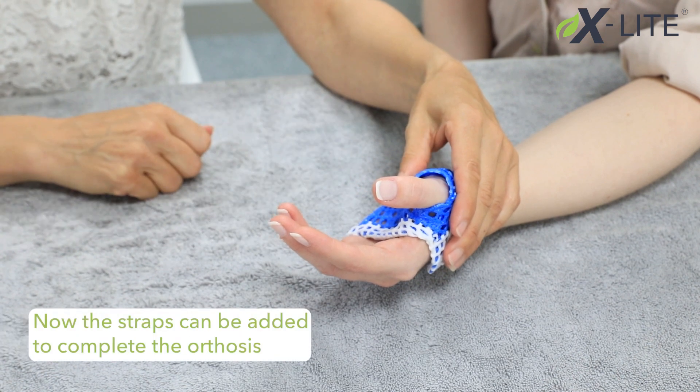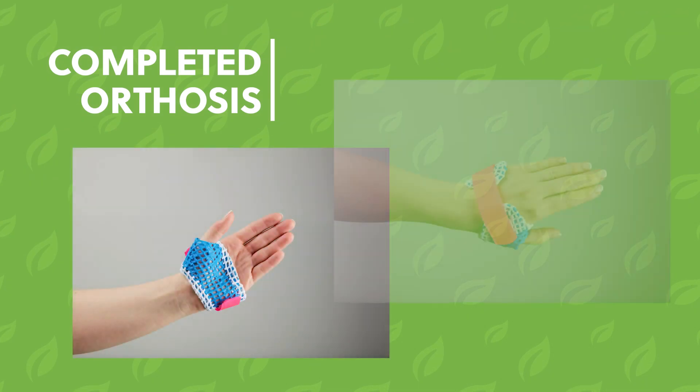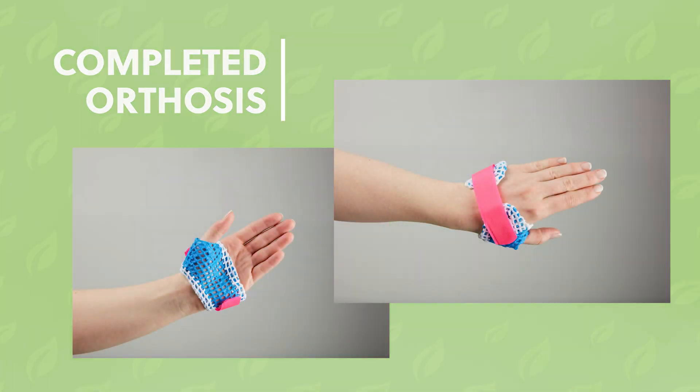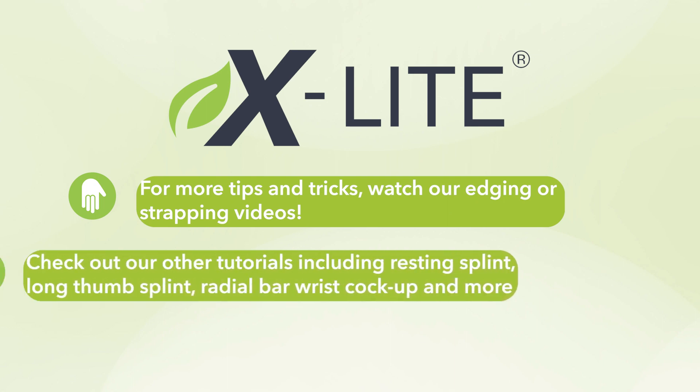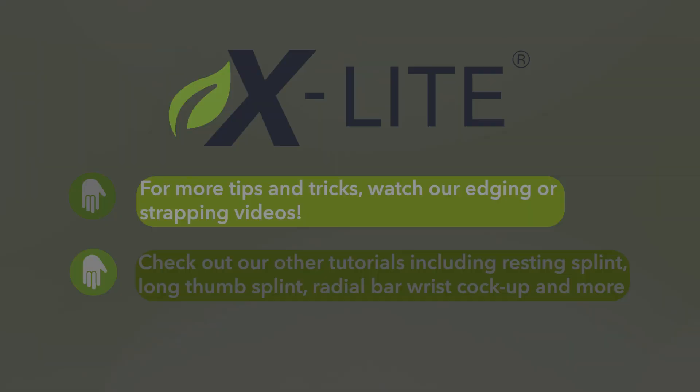Now the straps can be added to complete the orthosis. And we'll see you again next time.